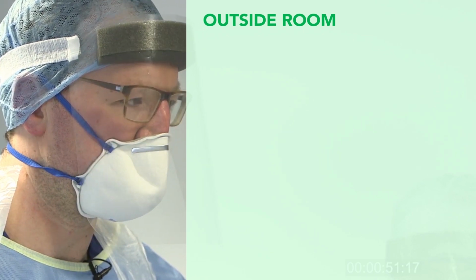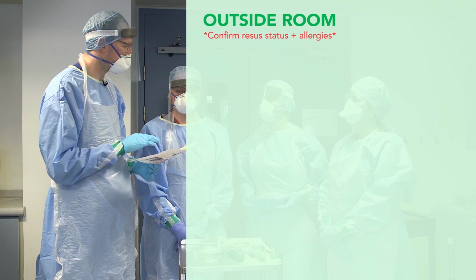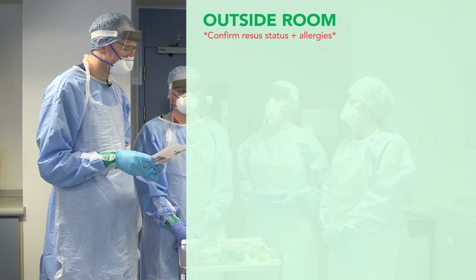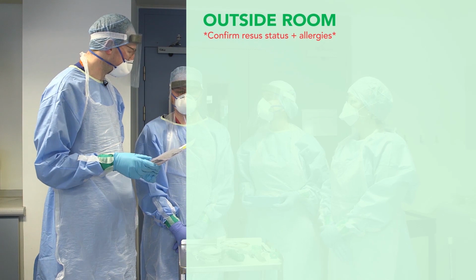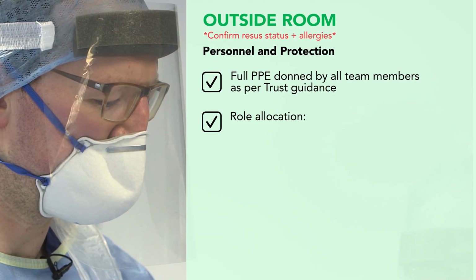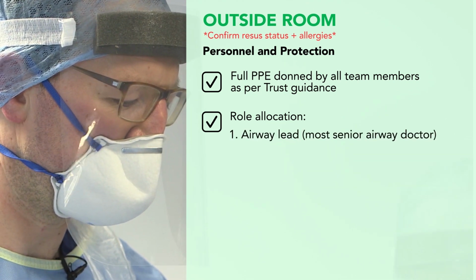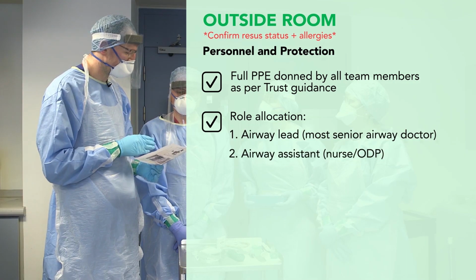So we're outside the room of patient X who requires intubation, and we're going to go through the COVID-19 tracheal intubation checklist. I'm going to start off by confirming the resus status of the patient. The patient's for resus. And Trev, does the patient have any allergies? No allergies. So we're going to start by allocating roles in the team. So I'm going to be the airway lead, the most senior airway doctor. Trev, if you're happy being the airway assistant.